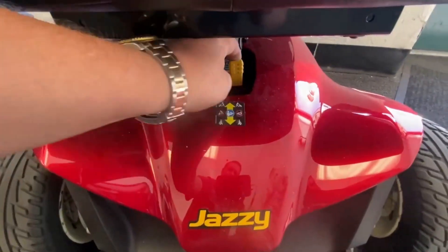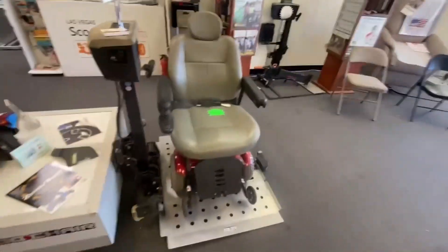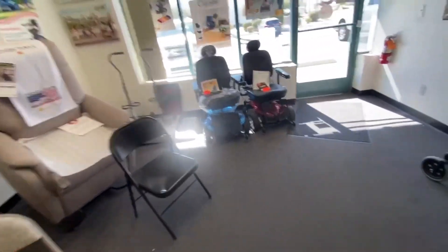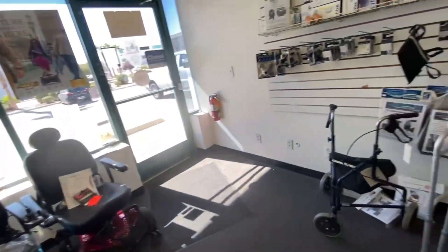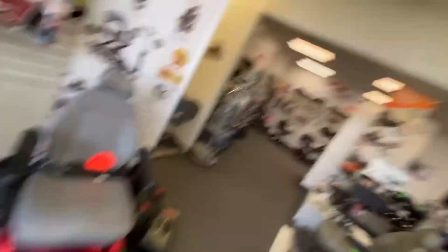I'm going to put this back and lift that back up so people don't trip over it. These joysticks also have locks on them as well. That's why I always say check your user manual — see what flashes actually correspond to, so you can self-diagnose it instead of having to lift a great big wheelchair into your car if you don't have a lift.